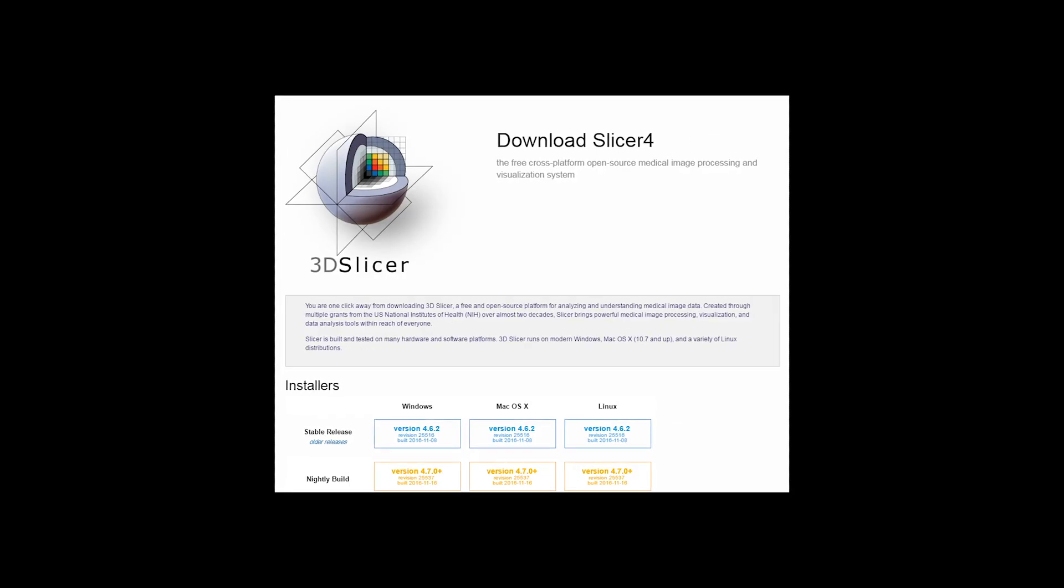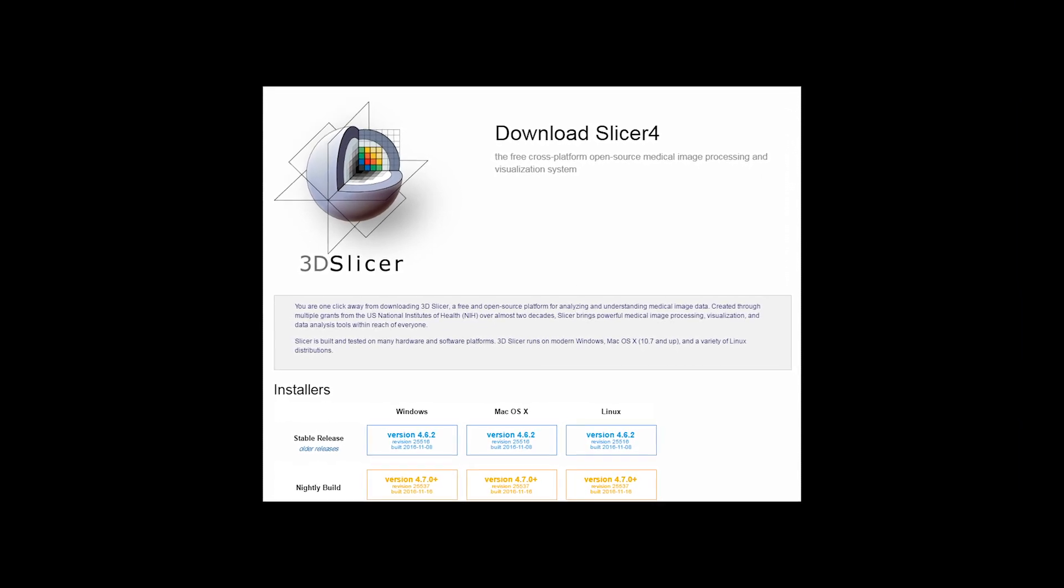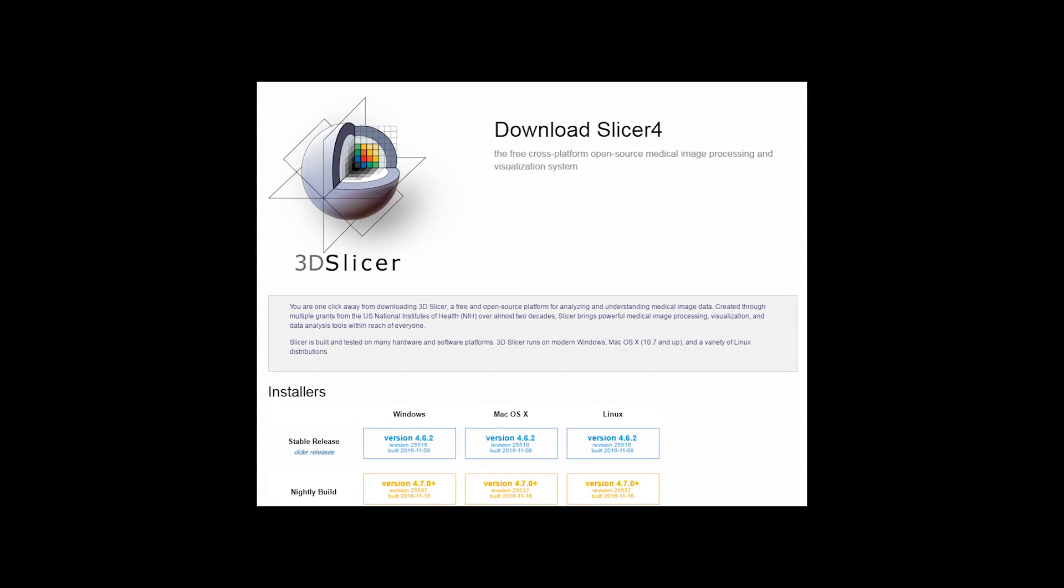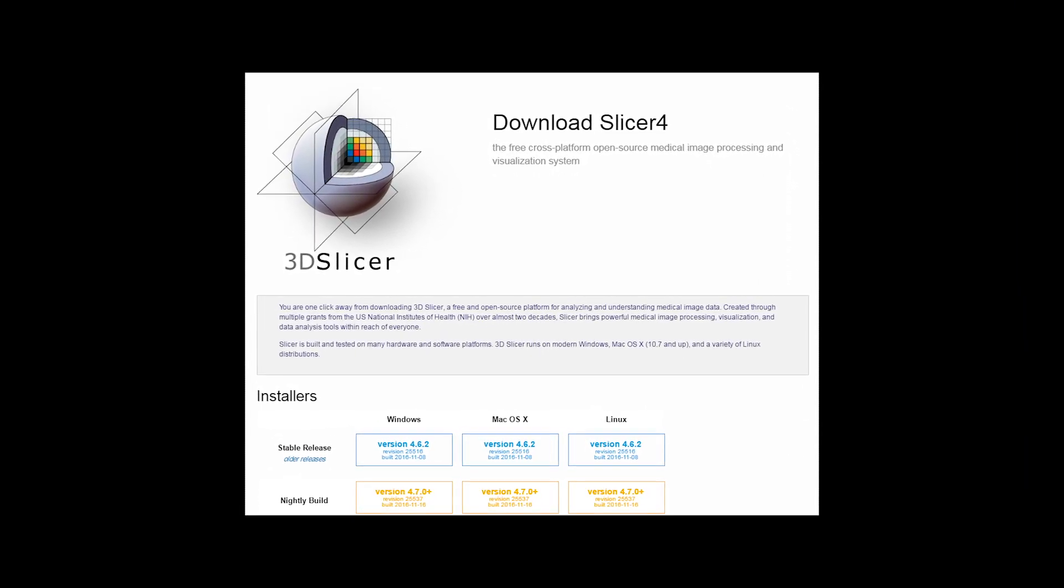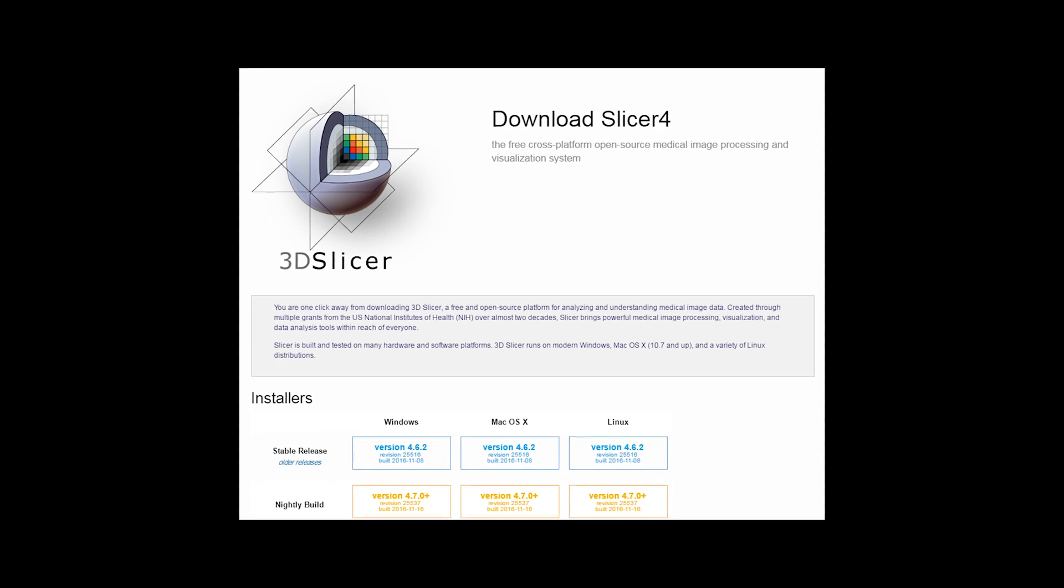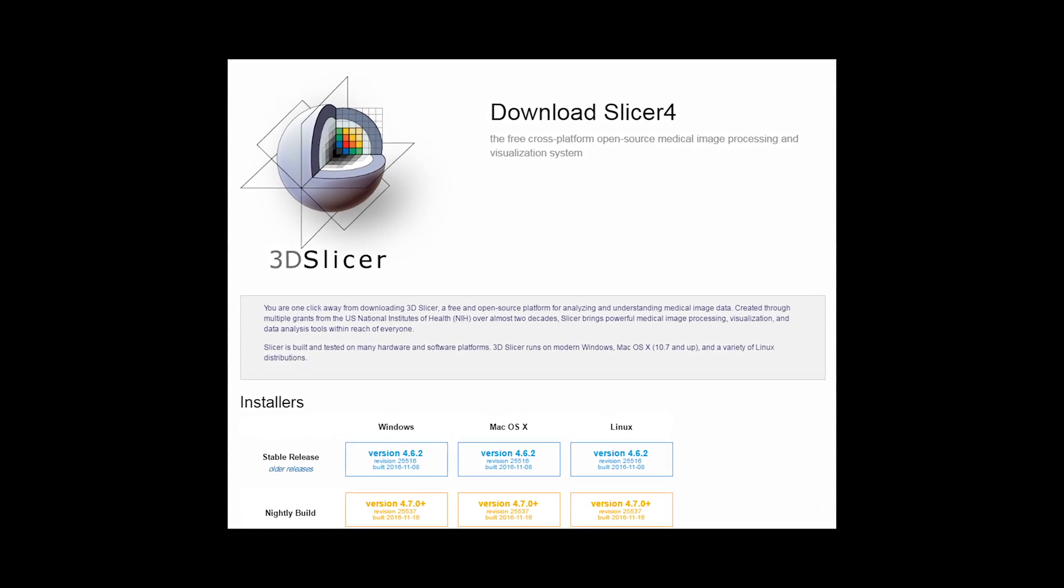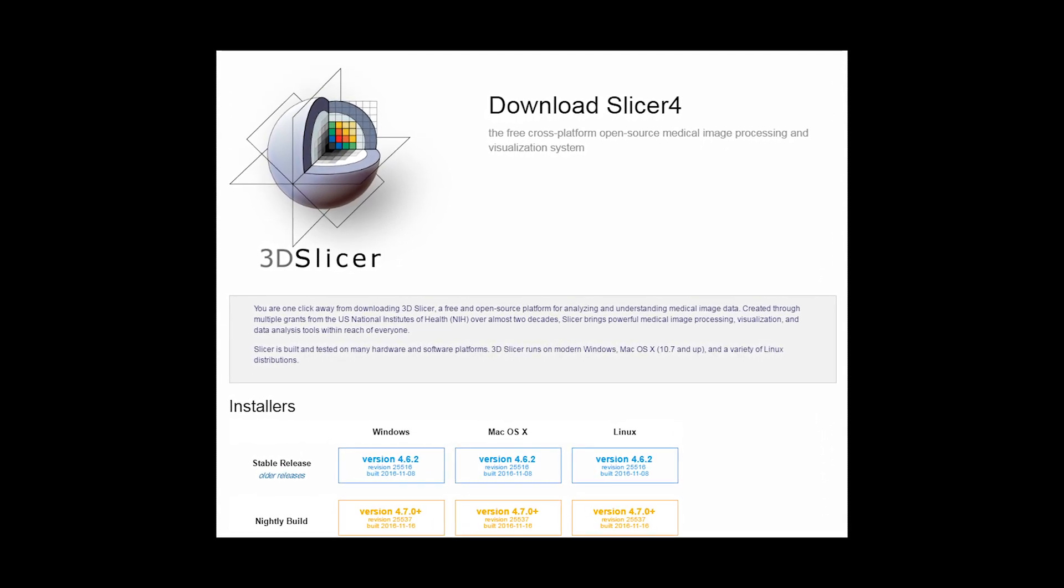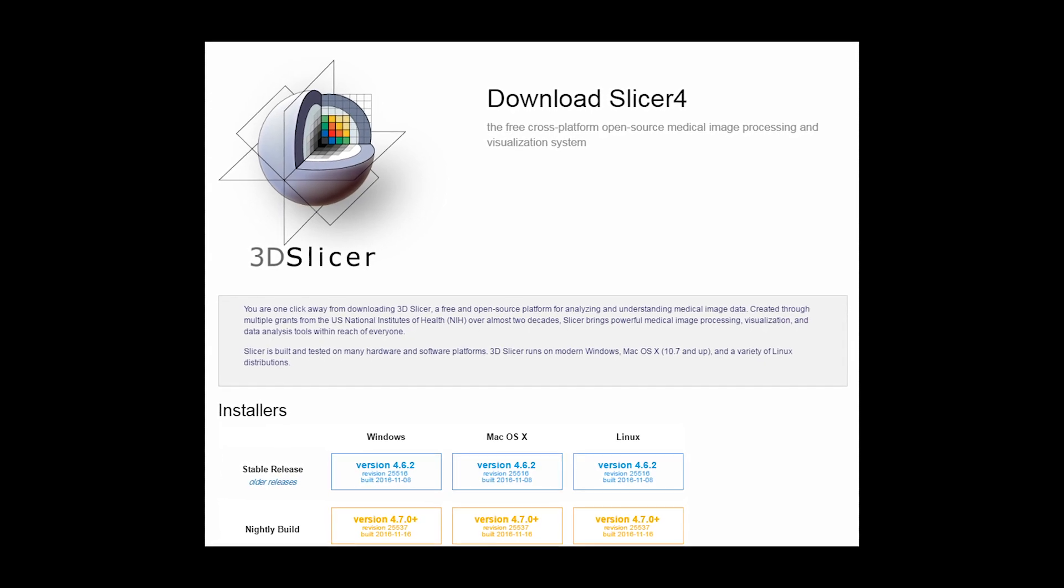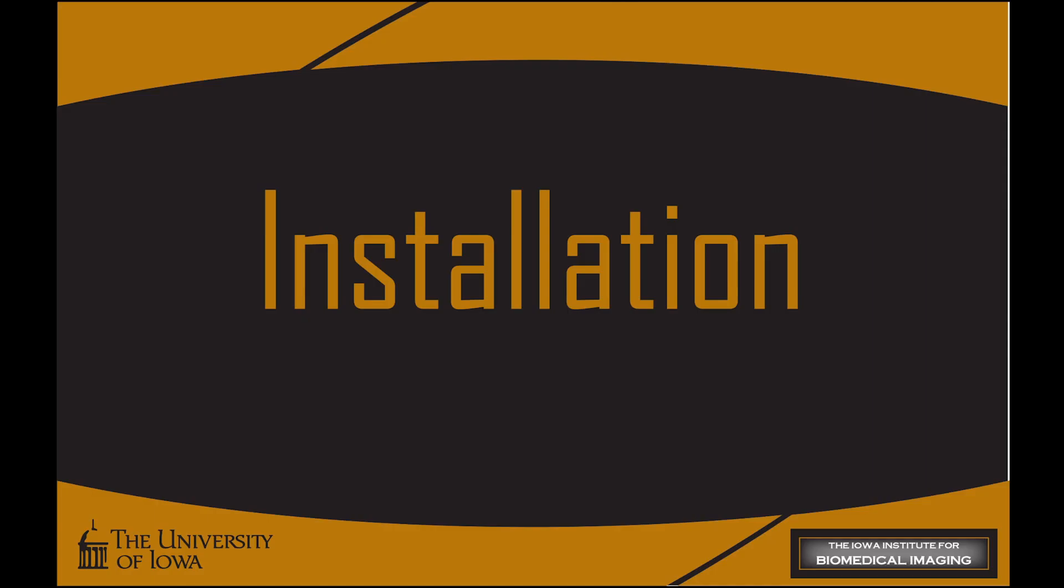In this example, we are using 3DSlicer version 4.6. Note that the tool is available for several versions of 3DSlicer. Please use 3DSlicer's Extension Manager to check availability for the version you are using.